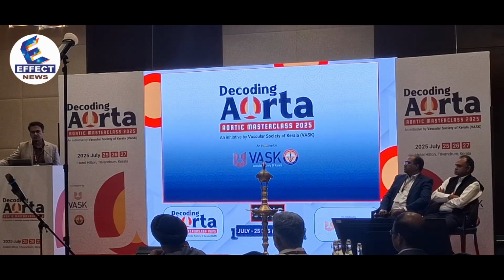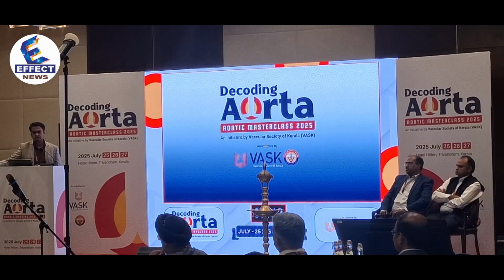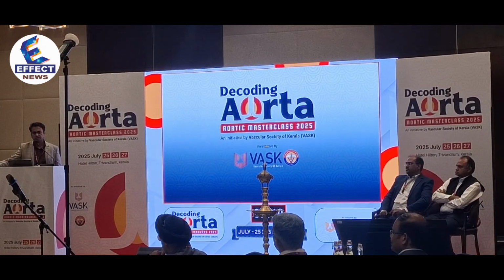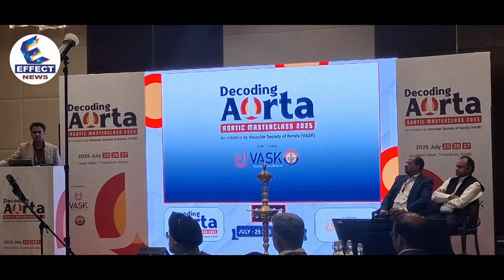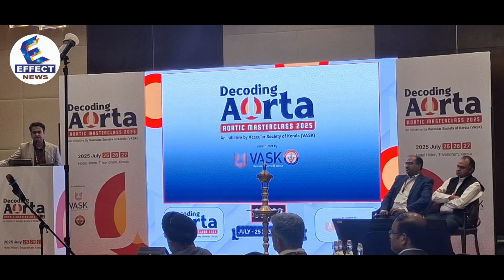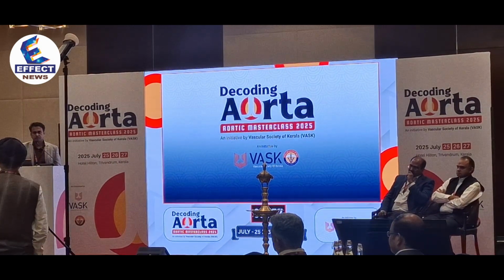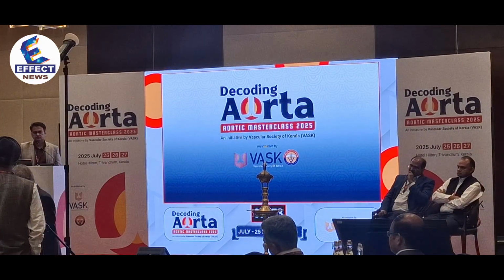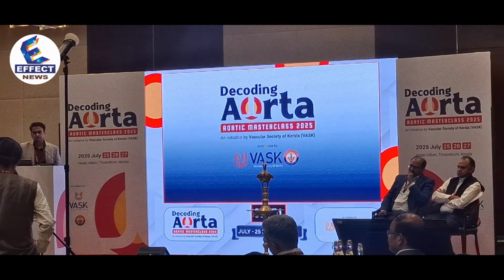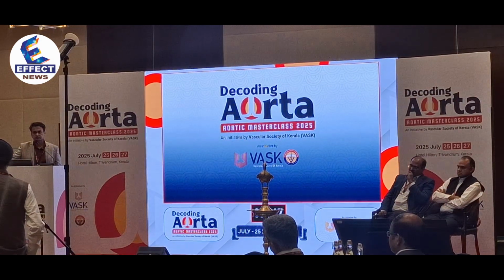Choose to go for a CT without contrast because, as Dr. Satish suggested, a CT without contrast can be tried first, so that we don't have to worry about contrast. NCCT, non-contrast, will give all the details. The problem with MR is basically that you don't really get submillimetric cuts. Correct. You get much thicker cuts with MR. So that is where probably the NCCT is any time better, because you can take submillimetric cuts and get a good study.